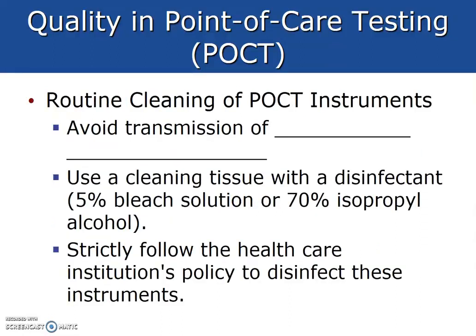Routine cleaning of the point-of-care instruments. We're going to avoid the transmission of bloodborne pathogens by using a cleaning tissue with disinfectant, 5% bleach solution, or isopropyl alcohol. It's really essential we clean the instrument in between each patient use.